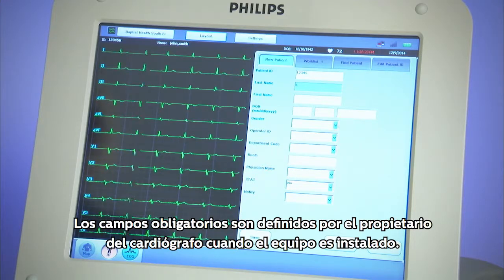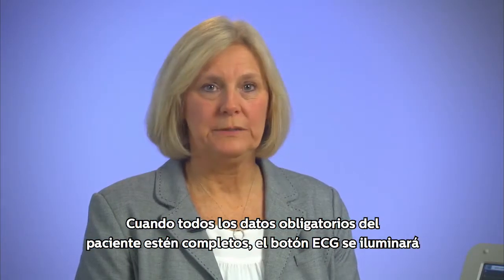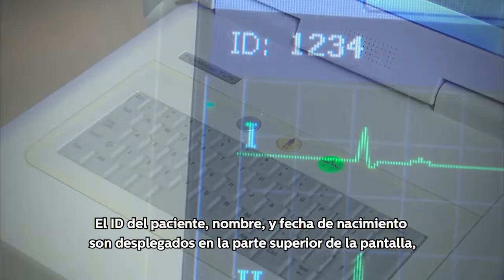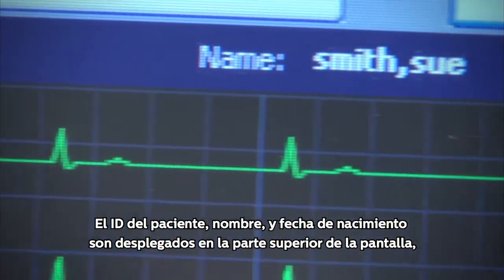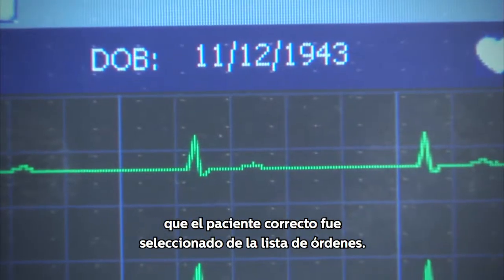Only the blue fields are required for the ECG to be correctly documented. Fields that are required are determined by the cardiograph owner when it is installed. When all the required patient data is complete, the ECG button will light up to guide you to preview the ECG. The patient's ID, name, and date of birth are displayed at the top of the moving waveform display so that the operator can verify that the correct patient was selected from the order work list.